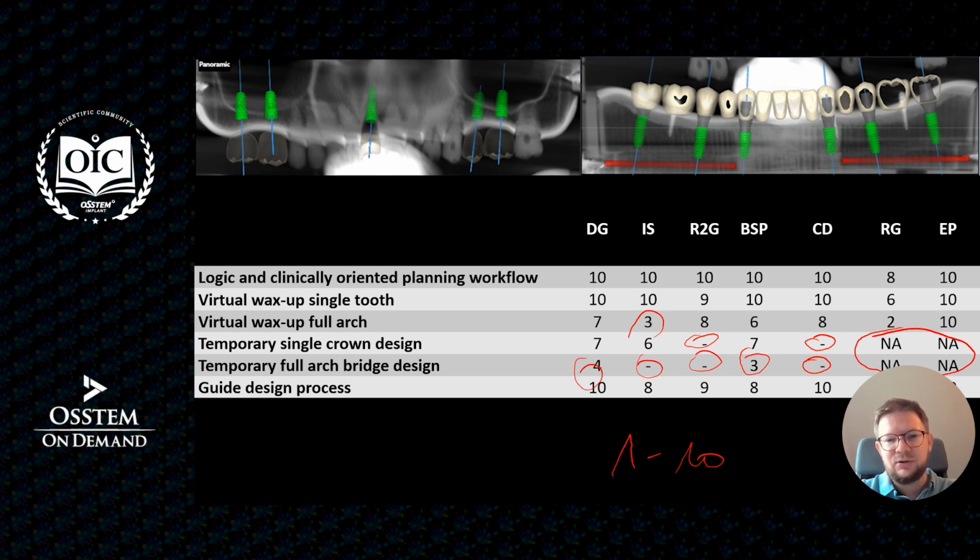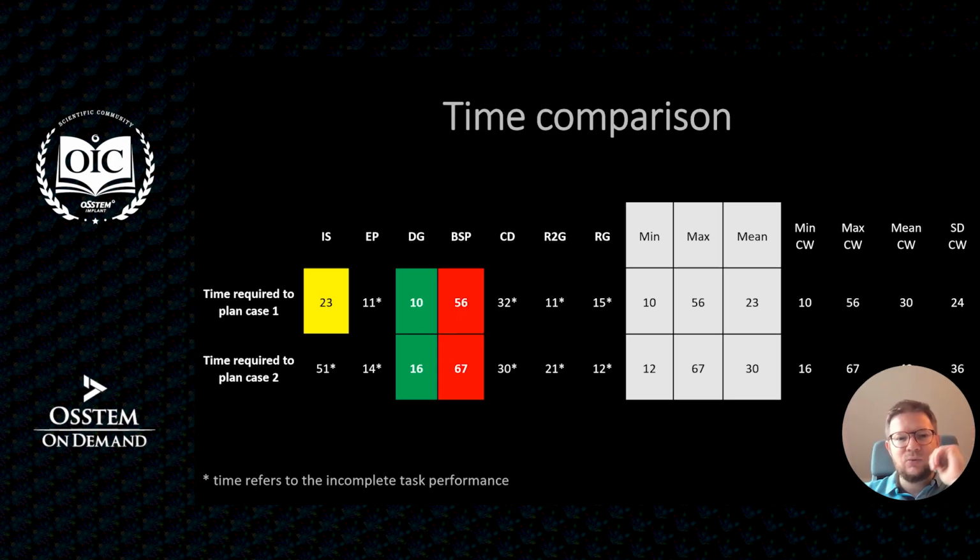So in general, each of the evaluators was an expert working with the software. Each of us knows his software quite well, and we are used to using that software, and we know the functions. So daily we are dealing with that. However, if we have a specific task given, the evaluation gets lower for some parts of our workflow.